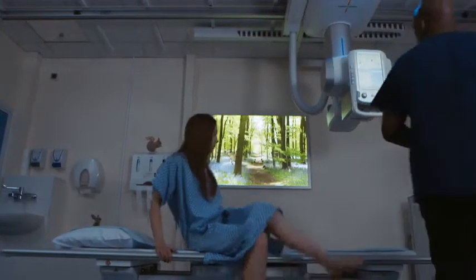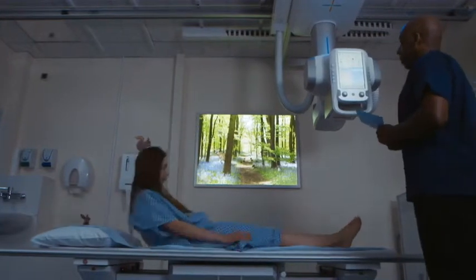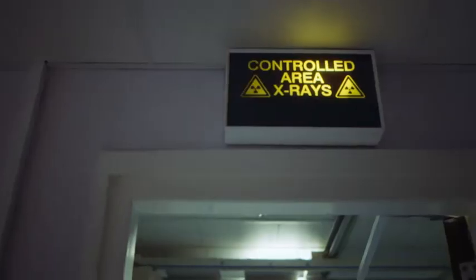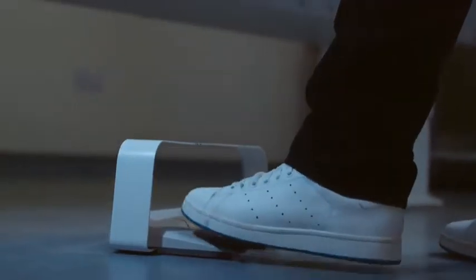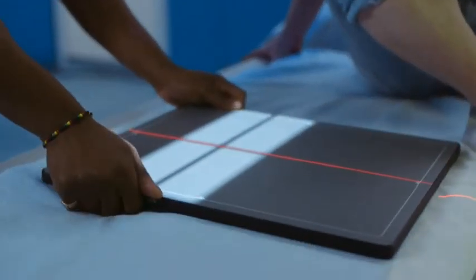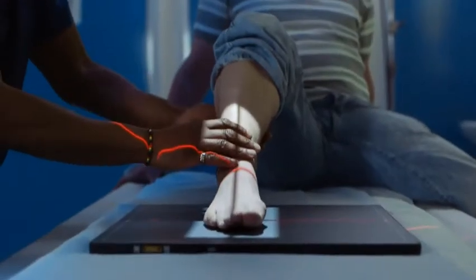With the old system, I would get the patient into the room, I would have a cassette, I would take the x-ray, and I'd have to leave the room to go out to process the x-ray, which could take about two or three minutes. The Samsung machine allows me to take the x-ray, view the image within three seconds, and then move on to taking more x-rays. We are easily allowed to double our productivity now.